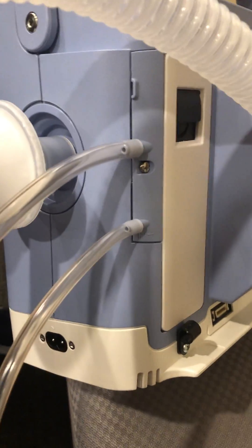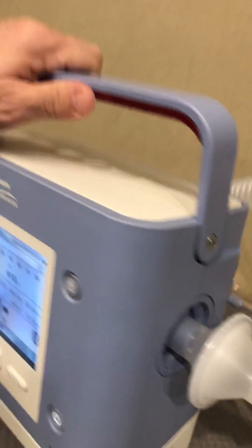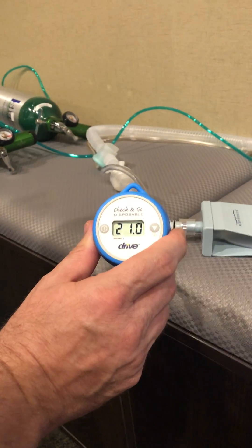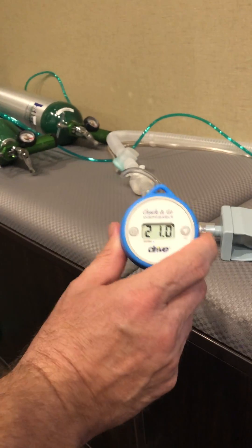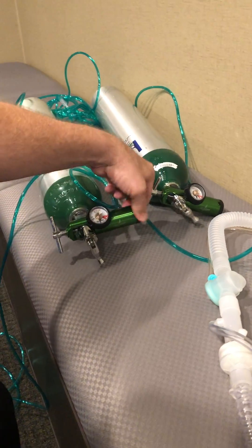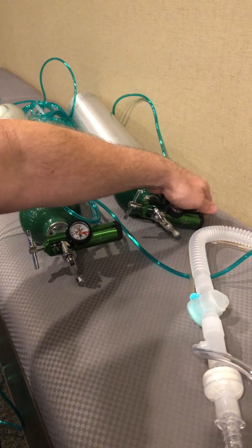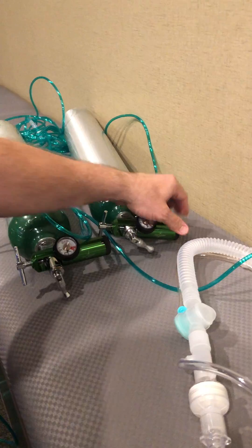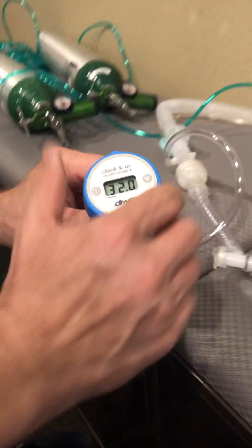As you can see with the O2 analyzer, we're roughly at 21%, which is the oxygen content in room air. I am now going to add oxygen at 16 liters per minute, being bled into the back of the machine via the connector.